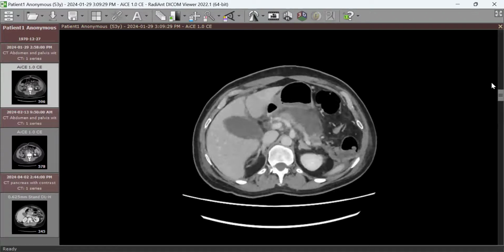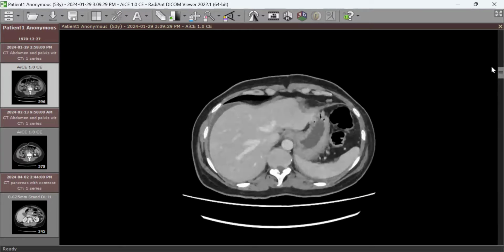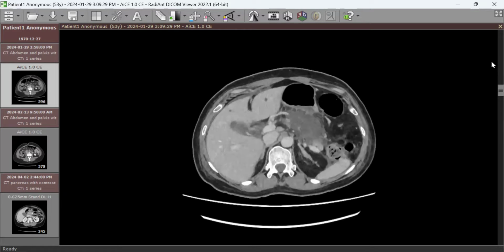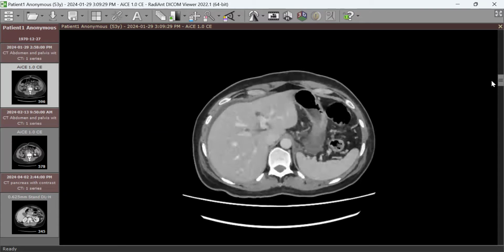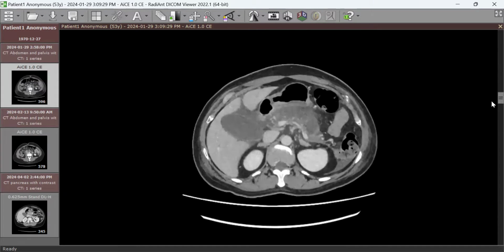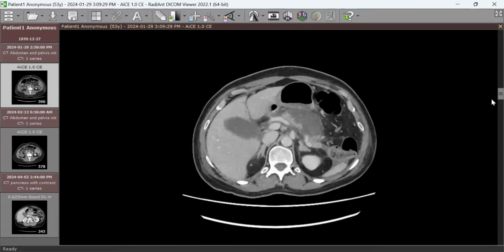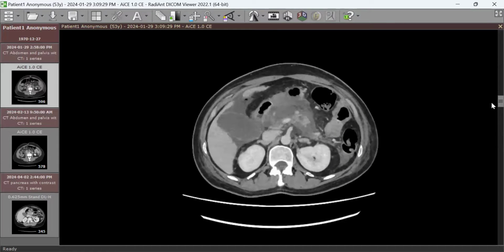Regarding alcoholism or alcohol abuse, what could be a hint in this scan? Fatty liver, if chronic. Yes, we don't see any obvious steatosis here. And another thing, if part of the pancreas itself is visible and seen, we can see a hint also regarding alcoholic intake, which is?